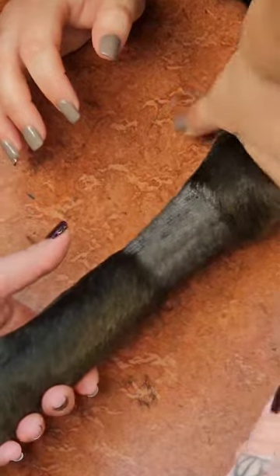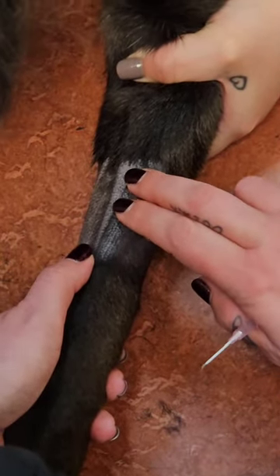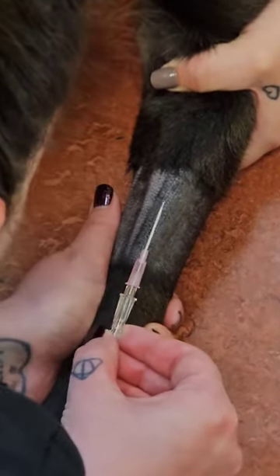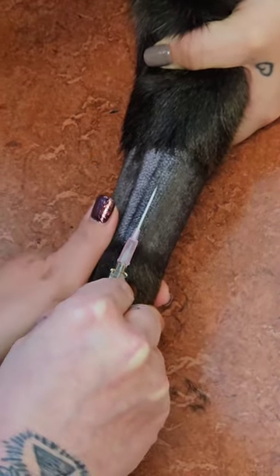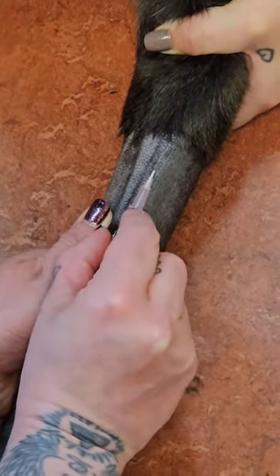The assistant is rolling the vein to make it more prominent and make the blood flow come when the catheter is inserted. Now you can see she is placing the catheter — she got a little bit of blood in the stylet, and as soon as she saw blood she advanced the catheter into the vein.